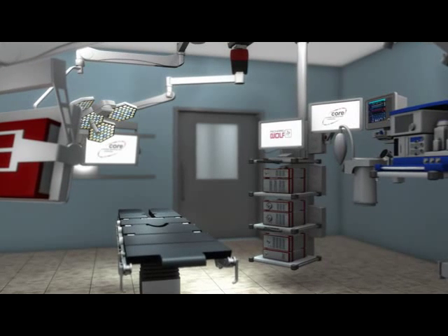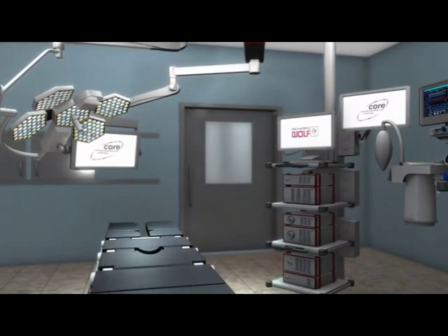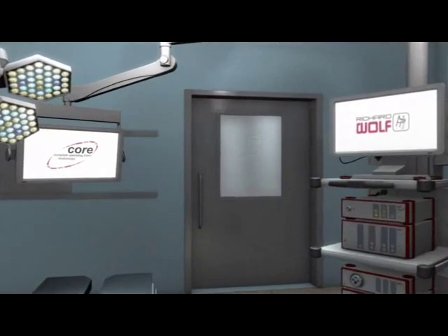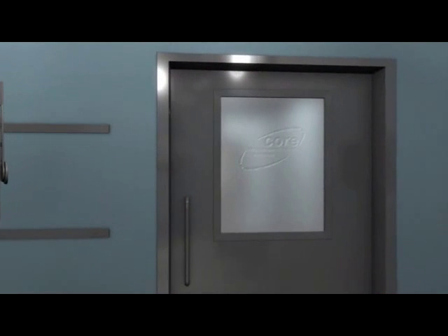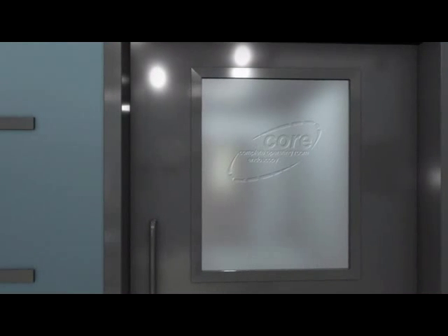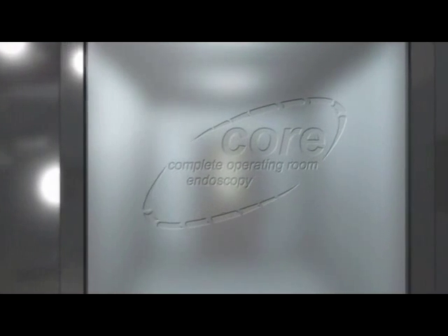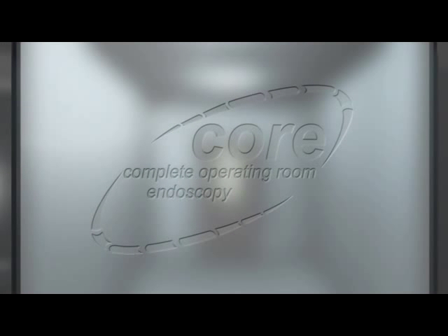As you can see, the integrated Core operating theatre provides a solution for lots of problems that can occur in a conventional operating theatre. Workflows and operation of equipment are optimized, and software integrated within the Core system makes light work of documentation. A design geared to practical applications means that Core is more than the sum of its individual parts.